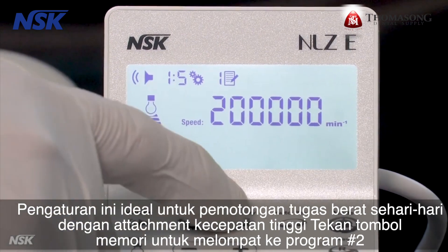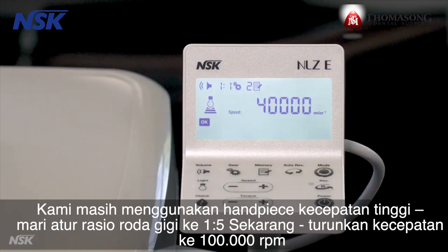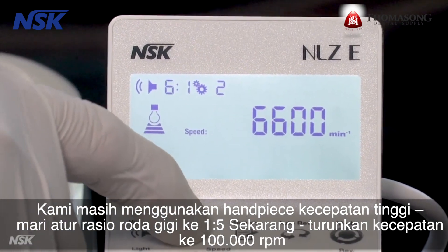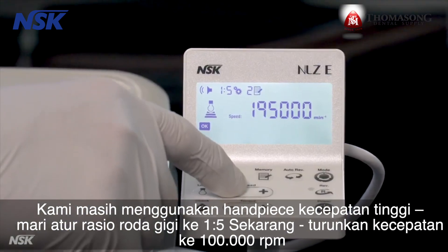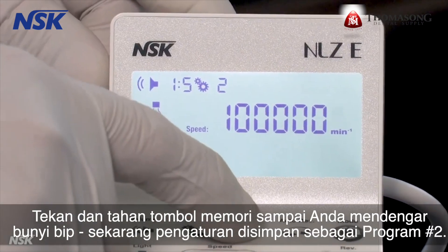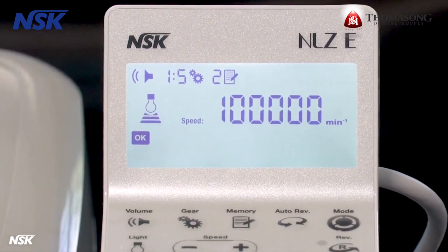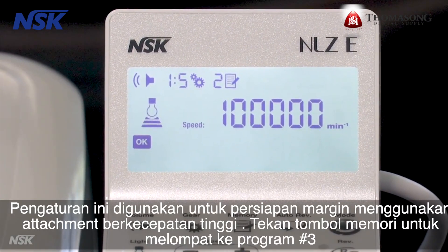Press the memory button to jump to program number two. We're still using the high-speed attachment. Set the gear ratio to one to five, then dial down the speed to 100,000 RPM. Press and hold the memory button until you hear a beep — the setting is now stored as program number two. This setting is used for margin prep using a high-speed attachment.